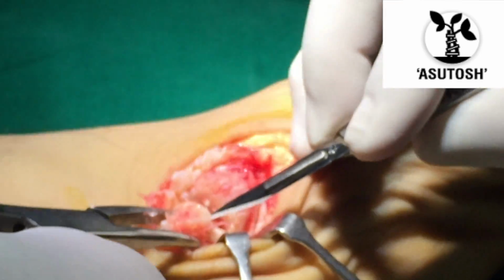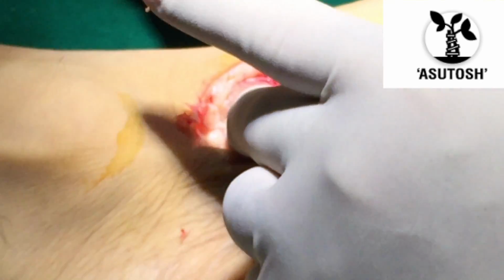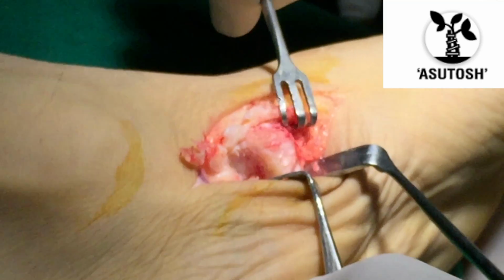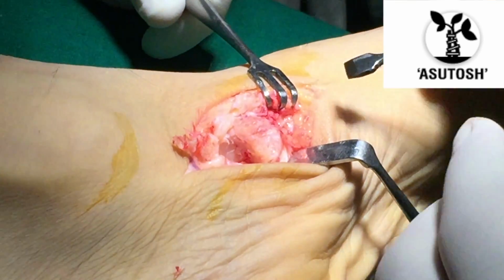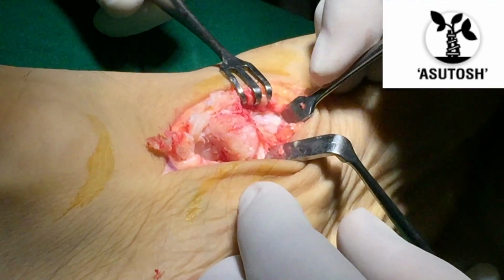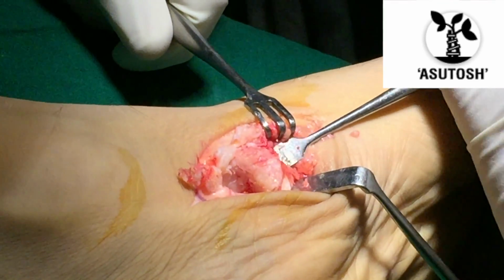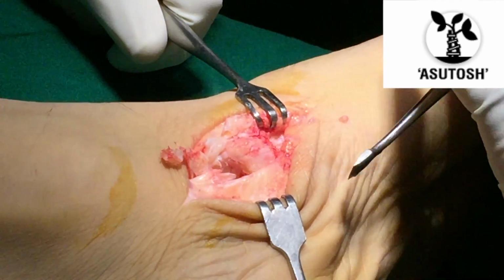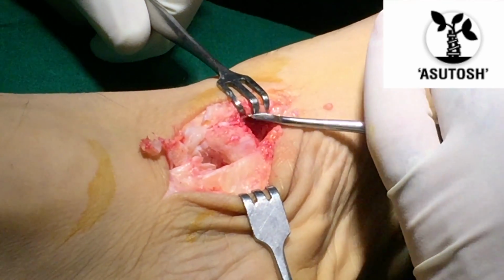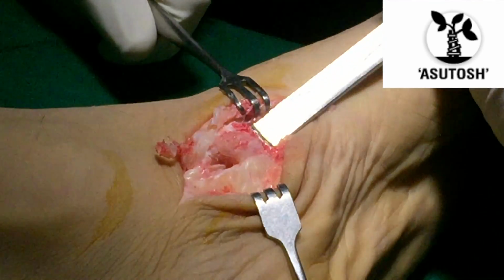With the help of a nibbler right now, we are removing the deformity that we can see. And with digital palpation, the remaining roughened surface is being palpated. And now we plan to remove it. Now we scrape a bit of the first metatarsal so as to check the level of the navicular portion that exceeds over the metatarsal. We isolate the extra navicular that is seen.